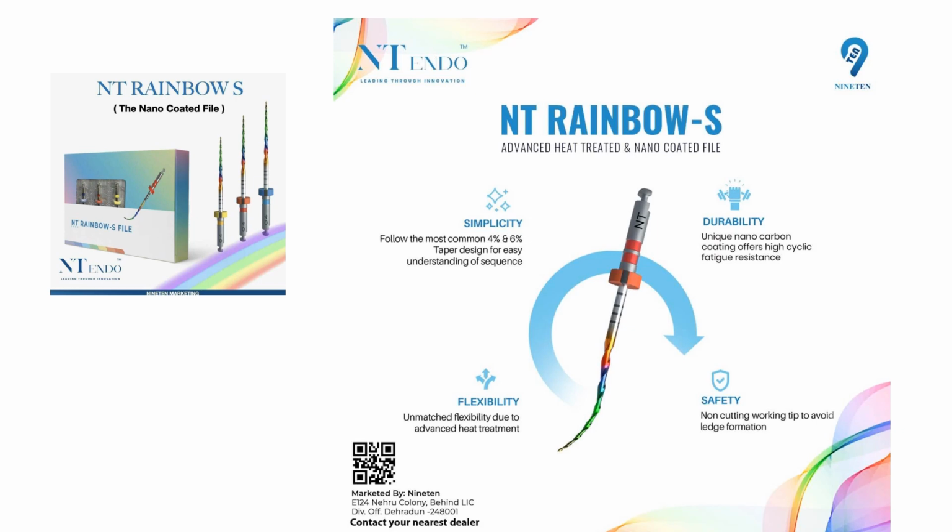Another file system is the NT file system. The NT Rainbow S files are very popular nowadays in the market, and these files are nano coated files. They are also made with advanced heat treated methodology, and they are nano coated.